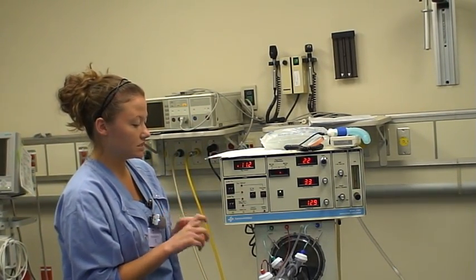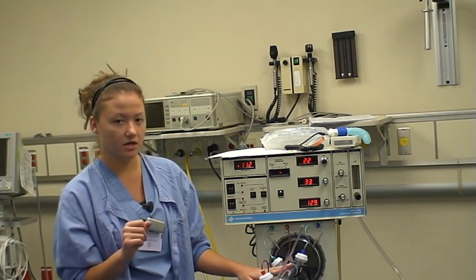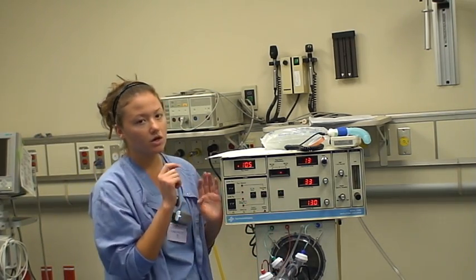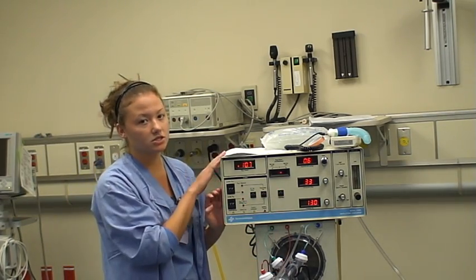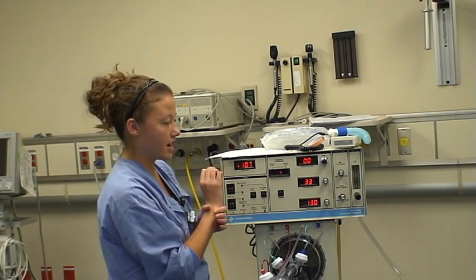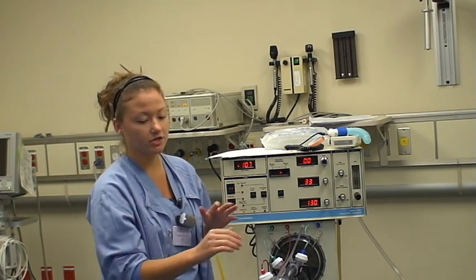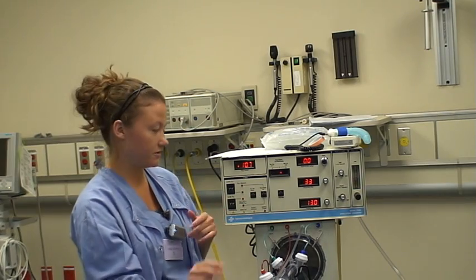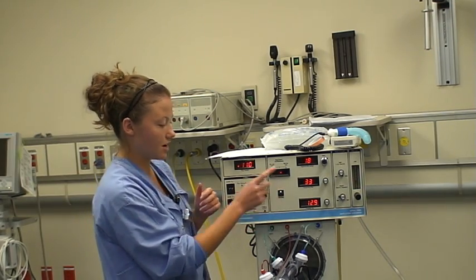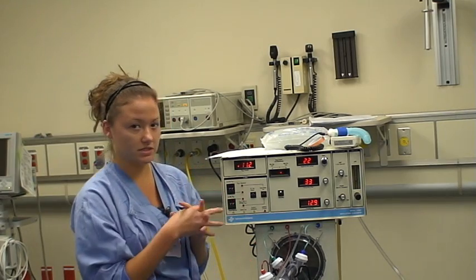If you want to stop and listen to the infant's lungs, you can pause it by hitting the start/stop button, which maintains your mean airway pressure as well as your FiO2. After you're done auscultating the infant, just hit the start/stop button and it resumes the amplitude and the frequency.